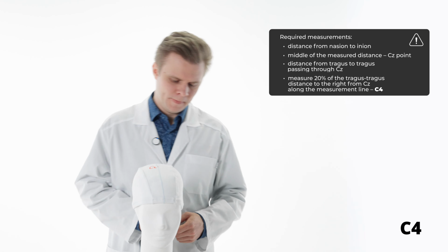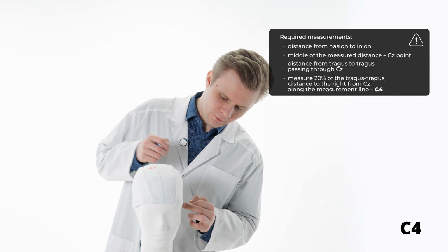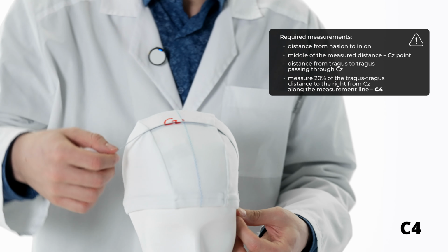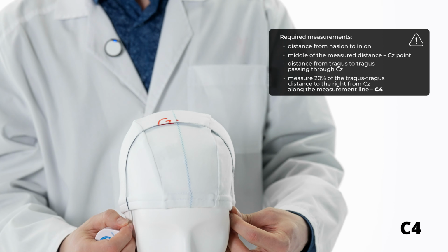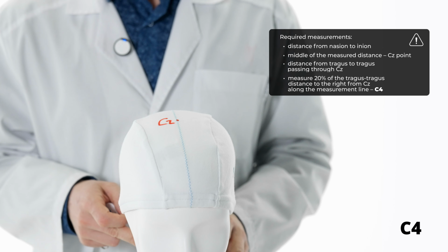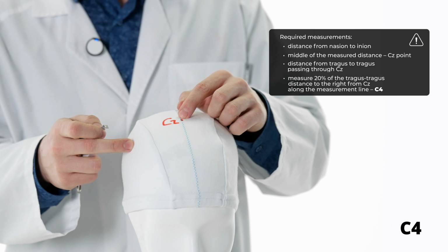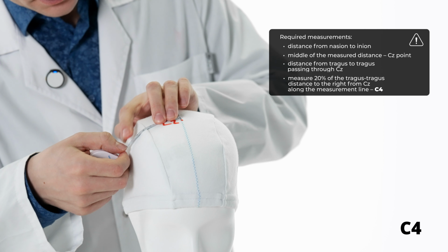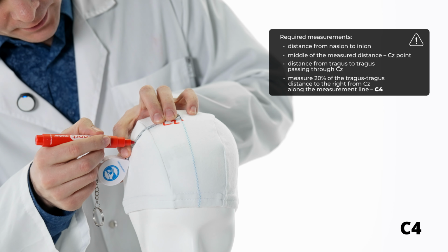Then, measure the circumferential distance in the coronal plane from the left to the right periauricular points through the Cz point. In our case, this distance equals 34 centimeters. C4 point lies 20% right from the Cz point along this line, or in our case, this distance will be 6.8 centimeters.